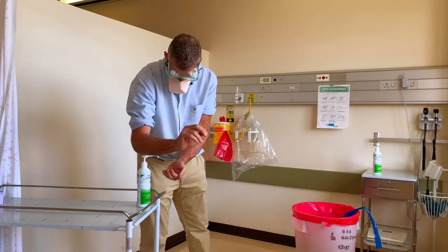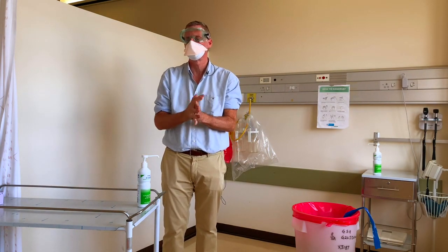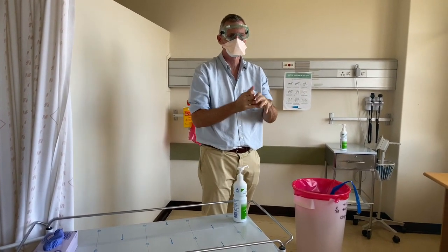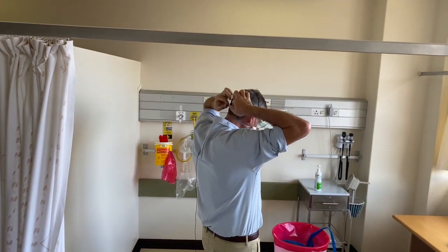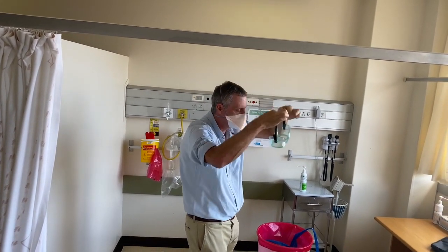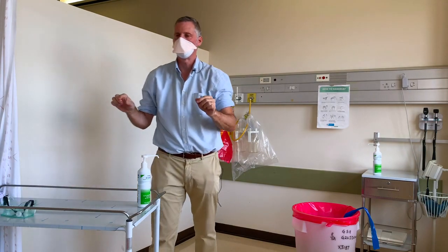I'm going to perform a little hand hygiene now. For the next piece of equipment — the goggles — you do not want to touch the front. Take your hands behind your head, find the strap, and remove the goggles in one flowing motion, placing them on a surface where they can be cleaned.